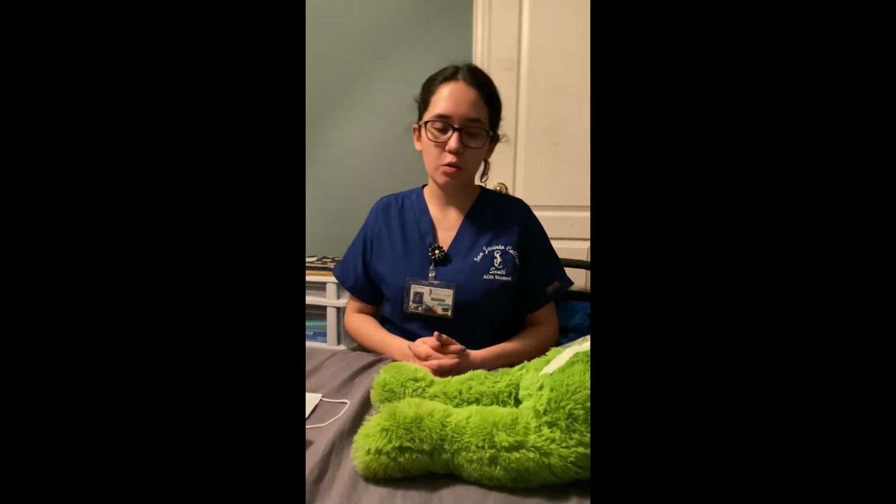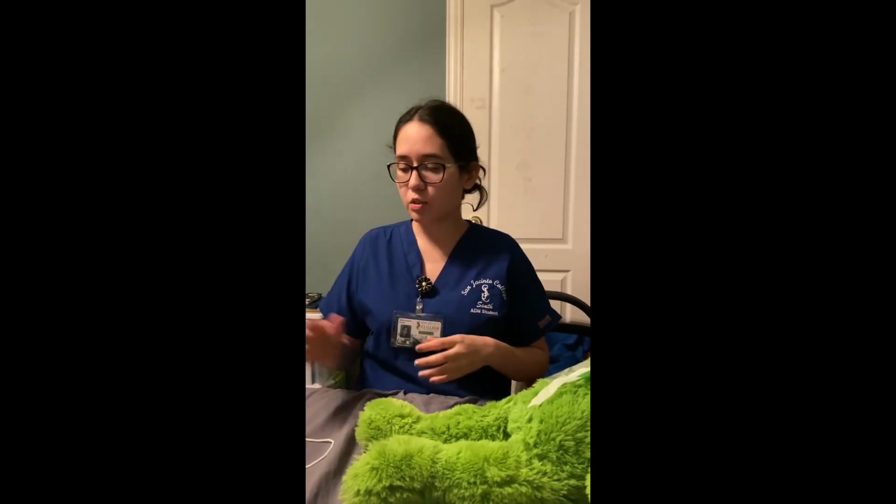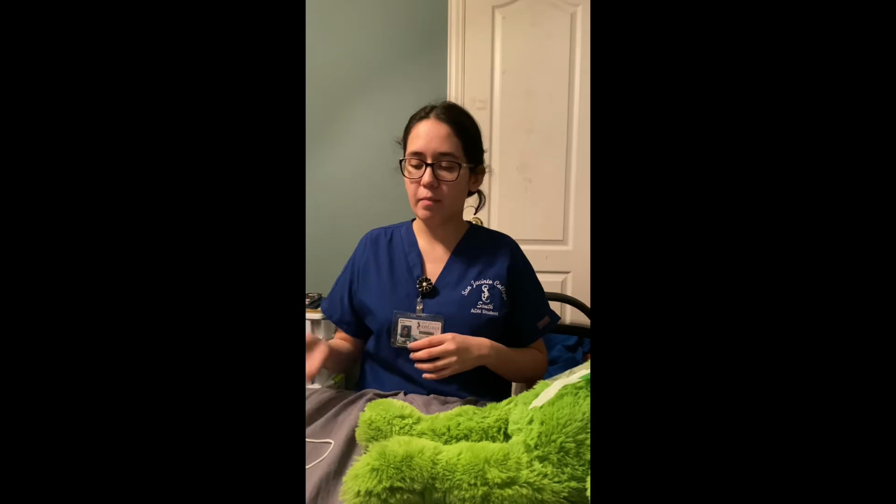Hello, my name is Daisy, and today I'm going to be performing the skills for a central venous line dressing change. So the first thing that you want to do is make sure that you have a doctor's order in place to be able to change the dressing on the central venous line. After you make sure that the order is in there and that you're in the patient's correct room, you want to gather your supplies, which include clean gloves, a mask, and your central line dressing tray.